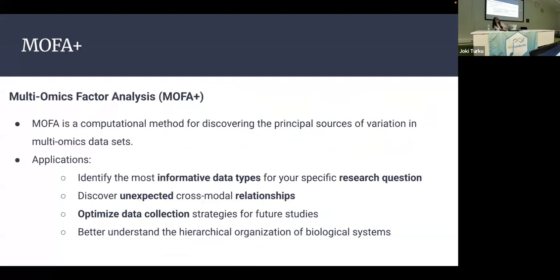And then just to conclude with the slides, and then we can just do stuff in R. In the 7th part of the R Markdown, we have MOFA, that is multi-omic factor analysis. It is a model that is really helpful when you deal with different types of omics or different types of input data. For example, with images, proteomics, bulk RNA-seq, it's going to compute factor values, just to see if different data tend to give you more information than the others.